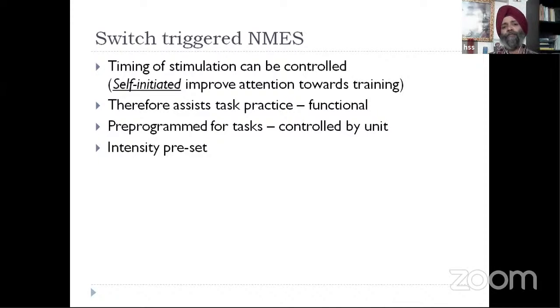Very important that the patient or the person can initiate the movement with volitional effort. What the person cannot change is the stimulation characteristics or the parameters, like, I want to grasp hard or I want to grasp light. Those stimulation parameters are pre-programmed. Once set and the switch is on, it produces those pre-programmed stimulation characteristics, which later cannot be changed.